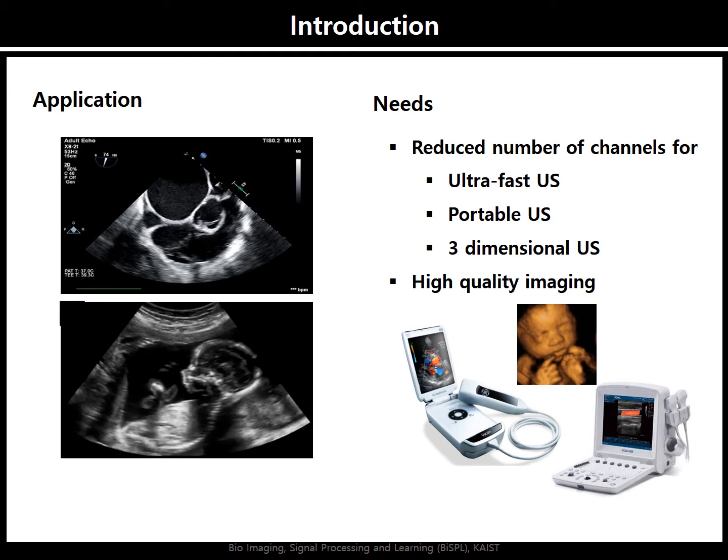Since the axial resolution of the ultrasound is confined by the quality of the transducer as well as the number of transducers, which has limited bandwidth, high quality ultrasound imaging requires a large number of measurements that result in increased cost, size and power requirements. On the other hand, there is an increasing demand for low power portable and 3D ultrasound imaging systems.